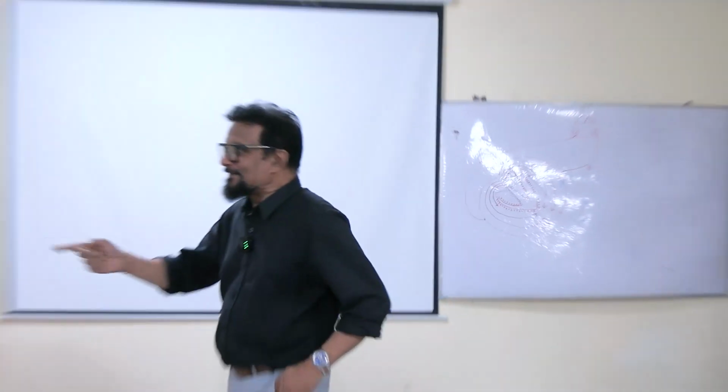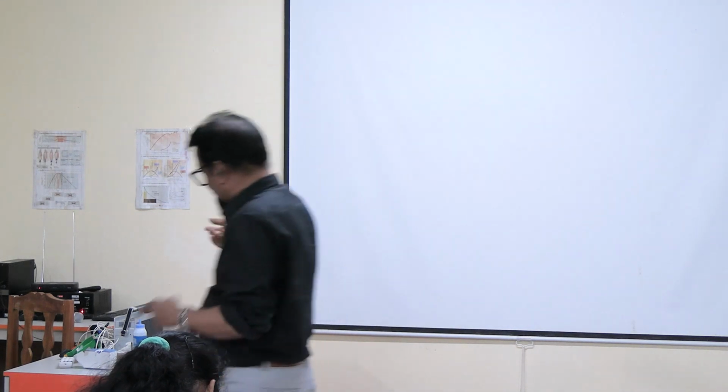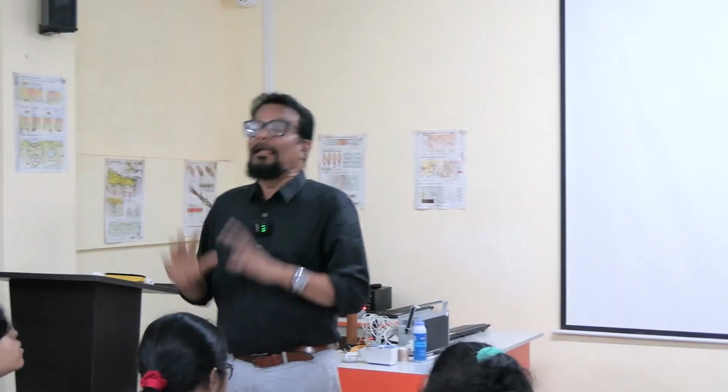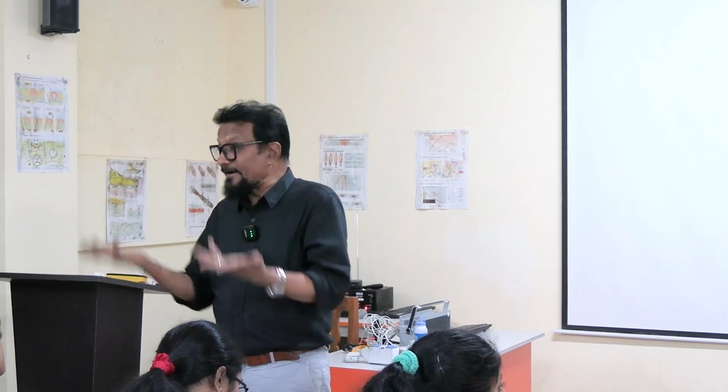Okay, so you can see the electrical activity of the heart that is generated in the heart. Now they are transmitting to our body surface. Now I can pick up this current using a voltmeter, using a machine. This is nothing but a galvanometer, an improvised, amplified galvanometer.